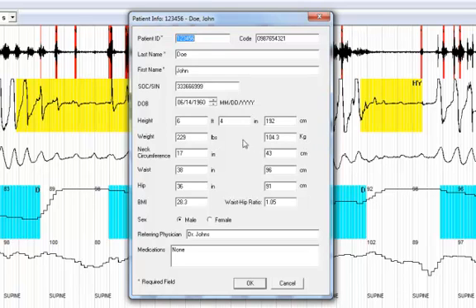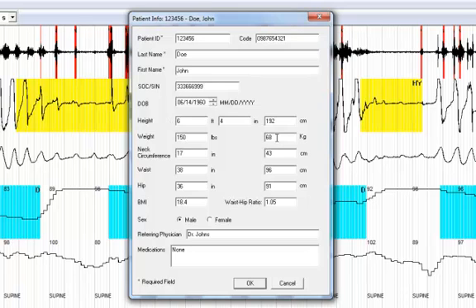If you automatically enter in the imperial measurement, for example, it will automatically calculate the metric equivalent. You need to tab between the fields to make the change appear.